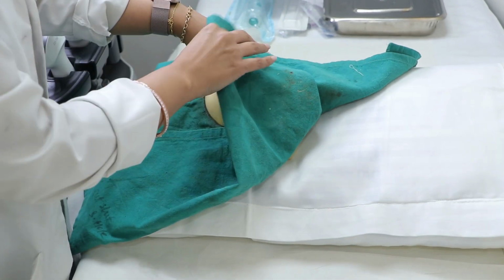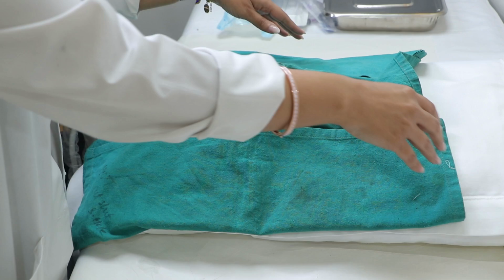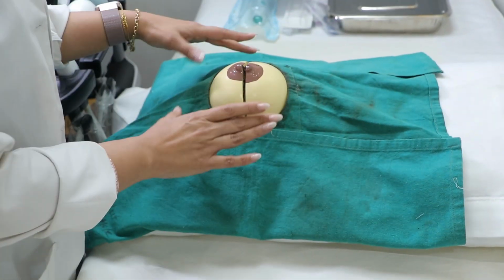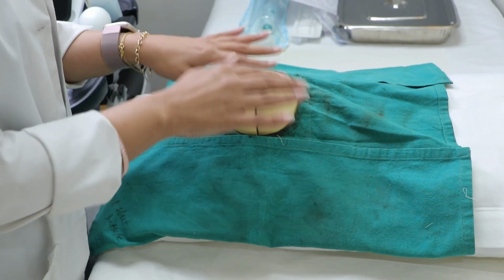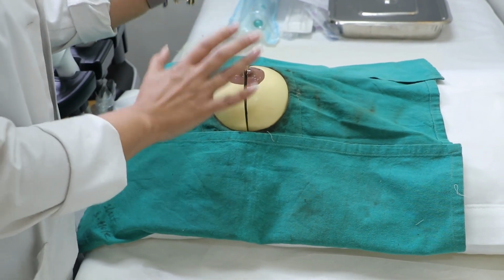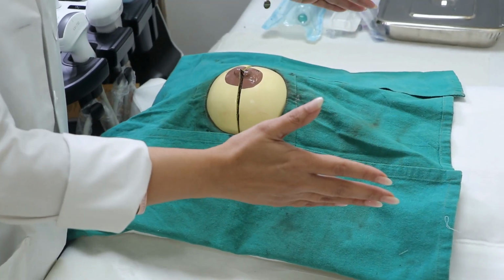So the patient will be, you can tell them to flex the legs so that they are comfortable. And you put a green sheet that has a hole in it so that the breast tissue is completely seen. Or you can even avoid that. You can just make sure that the patient is in this position, undressed from the top part.